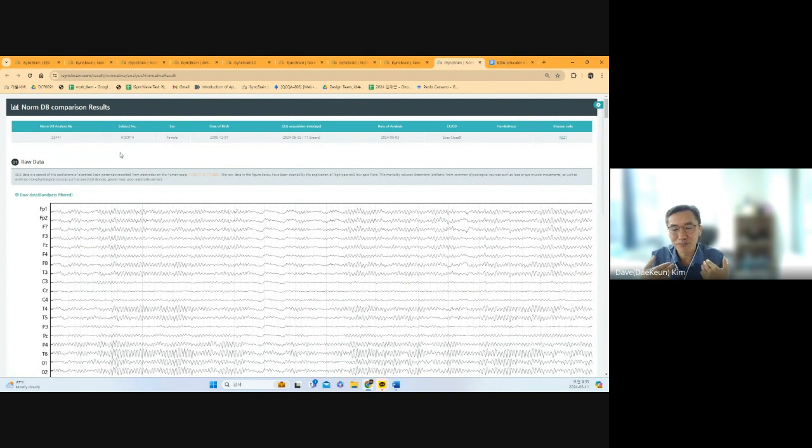In our experience, we can recover the MCI in 12 weeks, PBM 3 times a week and 10 minutes a session. This kind of high frequency alpha PBM, or sometimes the SMR PBM, also benefits their sleep quality and speeds up their slow brain oscillation.